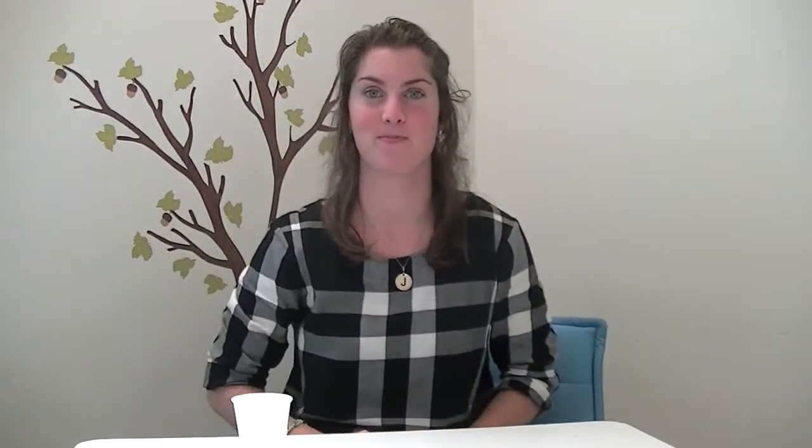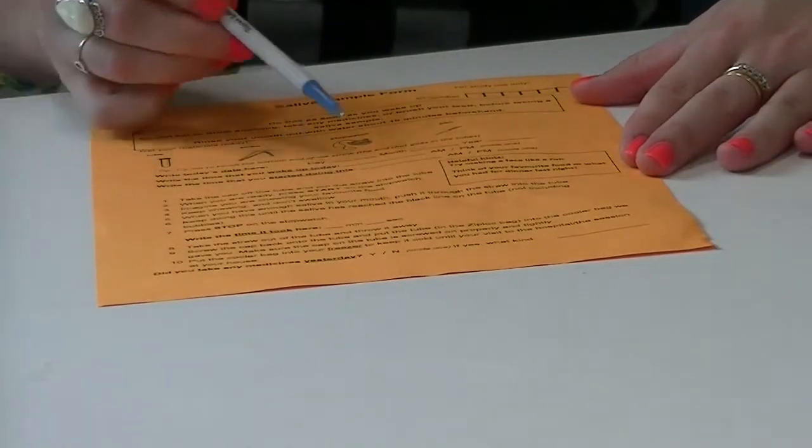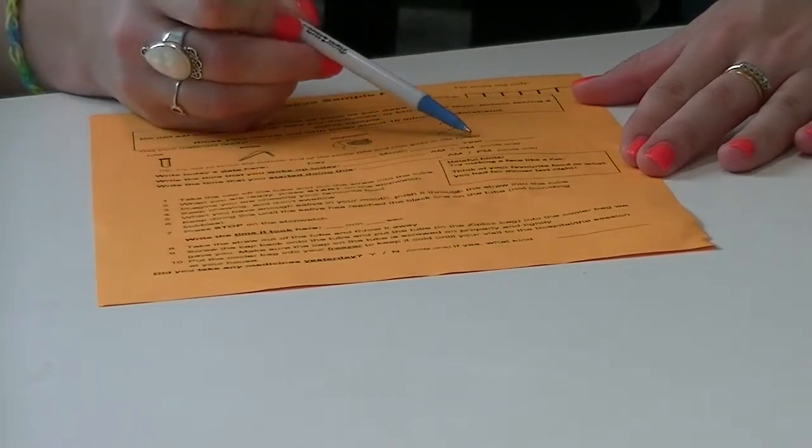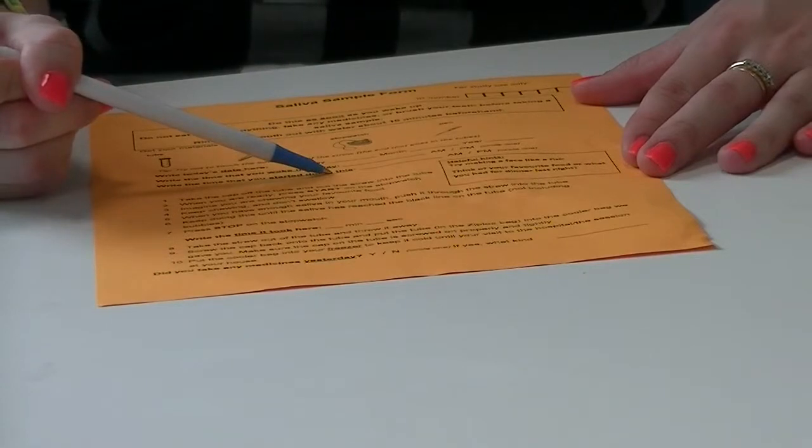Are you ready? 10 minutes later it's time to collect your saliva. Begin by writing the date — the day, the month, and the year. Then write the time that you woke up and the time that you started collecting your saliva sample.